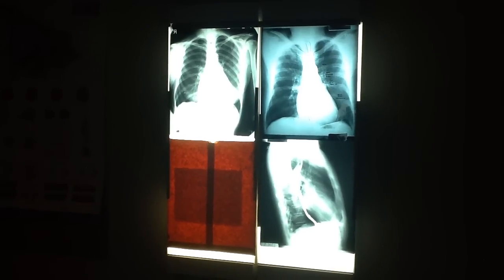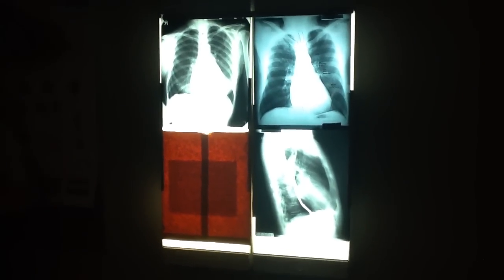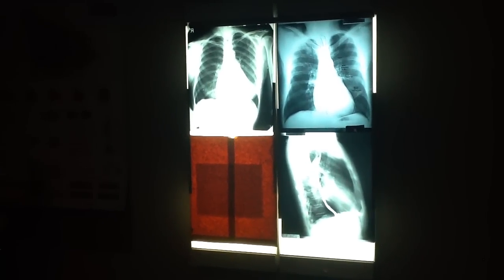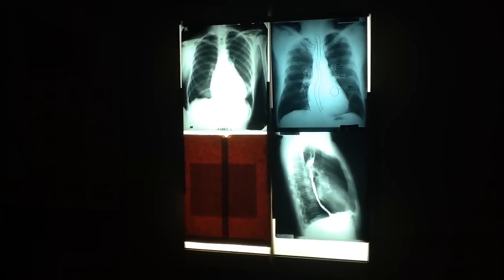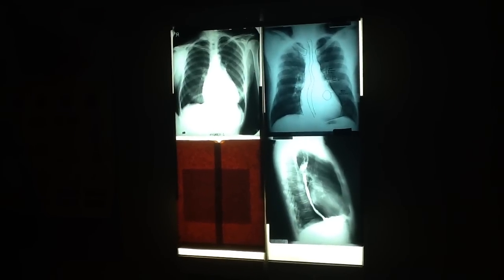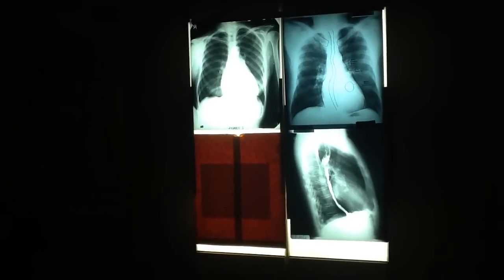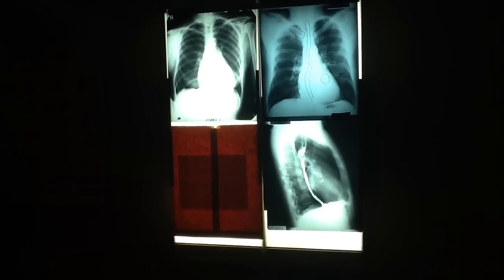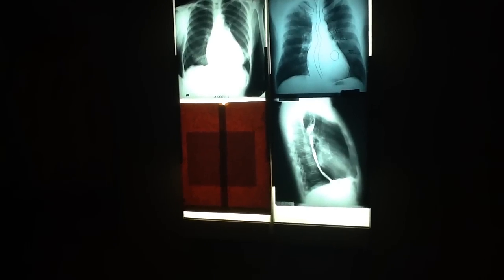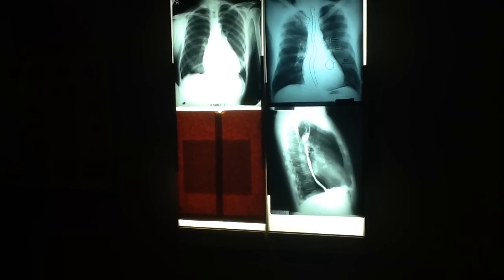So this is our last lab, and this lab deals with two things. It deals with cardiac alterations, which we started talking about yesterday. And we talked about the reason that we focus on what the cardiac silhouette and the cardiovascular silhouette is supposed to look like normally is so that we have some idea when it's abnormal what might be the problem.